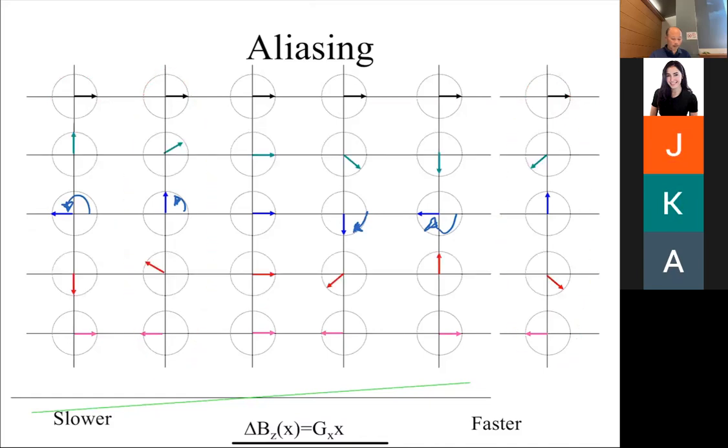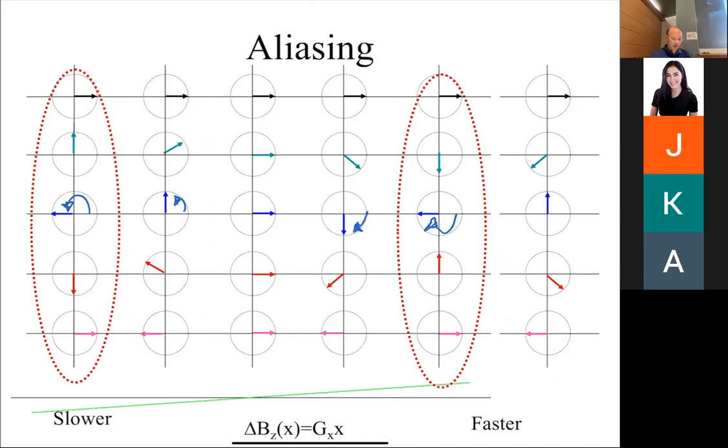Now if we look at those two things, you can tell this looks different from this, and this looks different from that, because I took a step this way, and that's different from taking a step that way. So that's the whole idea: the step going in k-space from here to here is some delta k. And if I take too big of a step, then I miss the interesting things happening at smaller intervals, okay?